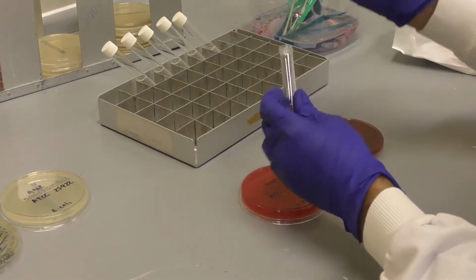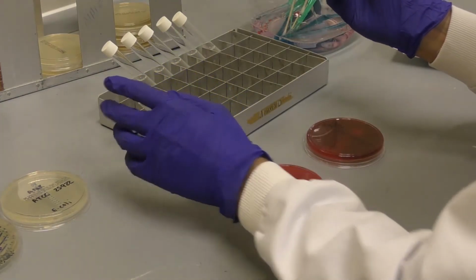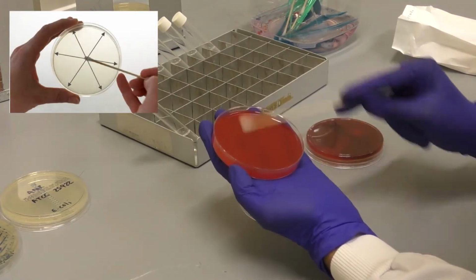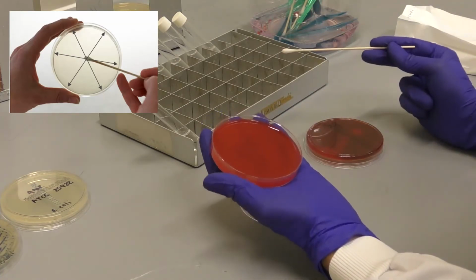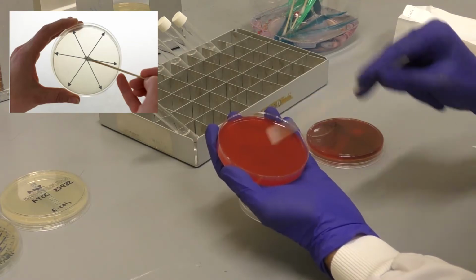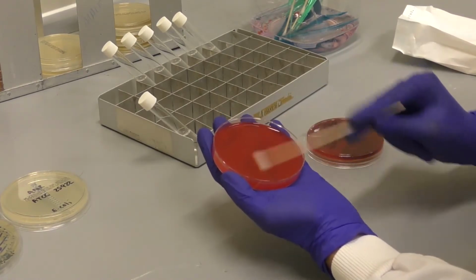You dip a sterile cotton swab into the mixed suspension and remove excess fluid by turning the swab against the side of the container. This is important to avoid over-inoculation of the plate. Then spread the inoculum evenly across the entire surface of the plate by swabbing in 3 directions. Take particular care to ensure there are no gaps between streaks. Once this is done, check the inoculated agar surface is completely dry before applying gradient strips.